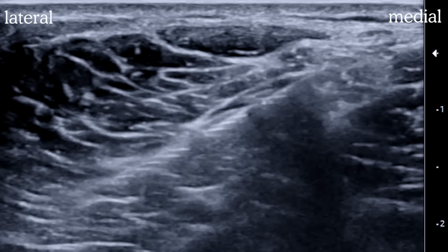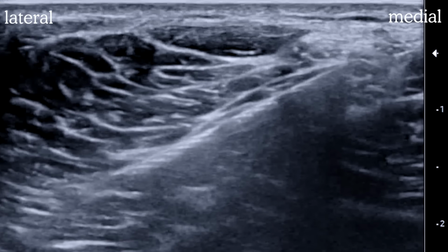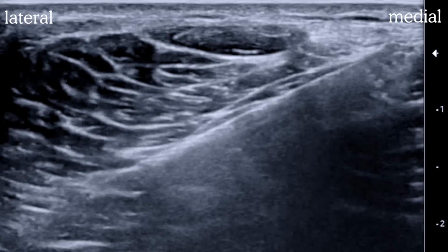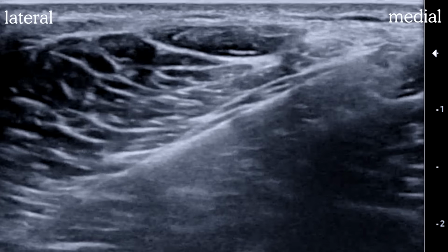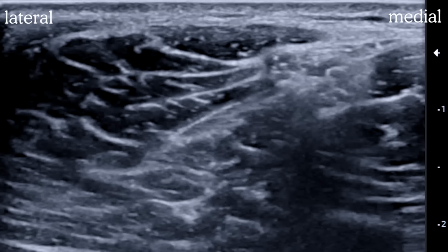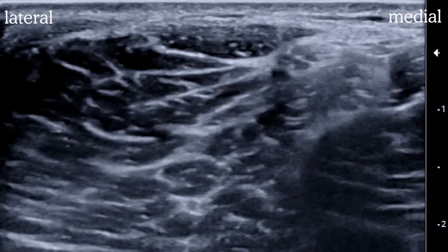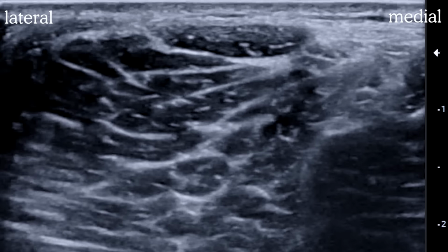Aiming the needle between the two nerves, pressure is applied to the perineural sheath and the needle gradually advanced. Take care not to aim at either nerve. Sometimes the sheath will indent a lot before the needle passes into it. That's okay. A test injection shows flow outside the sheath. We're still not there. There's often a big give as the needle passes into the sheath.